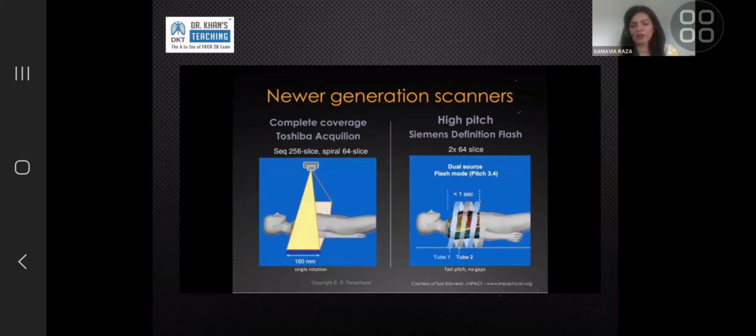It's not just the heart beating, the patient is breathing as well. So there are multiple ways artifact comes in. Just before the contrast goes in, the patient can have a sudden change in breathing, or they can move. So the artifact comes not just from the heartbeat, it comes from the breathing as well. And breathing can ruin any scan, even if you have a 16 centimeter detector. If the patient is moving or breathing, the scan isn't good.